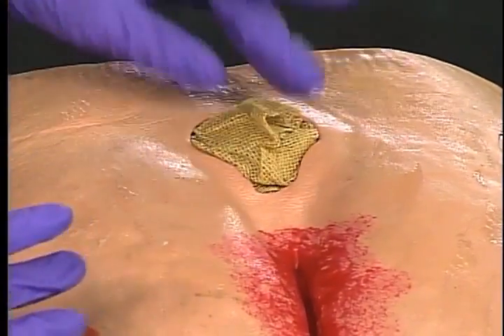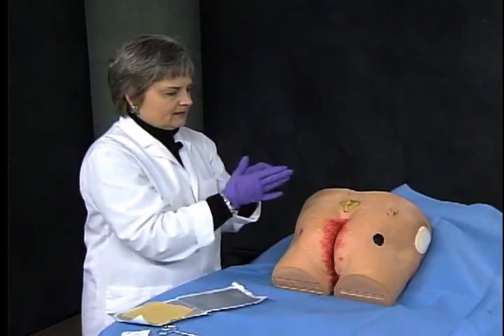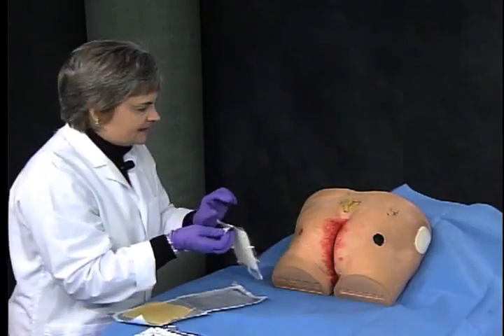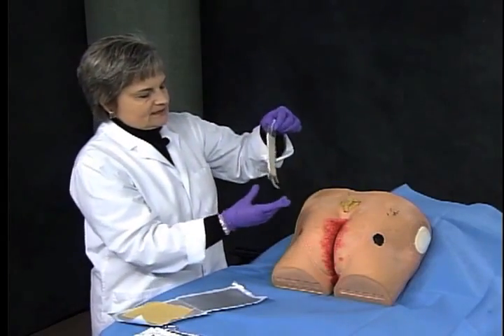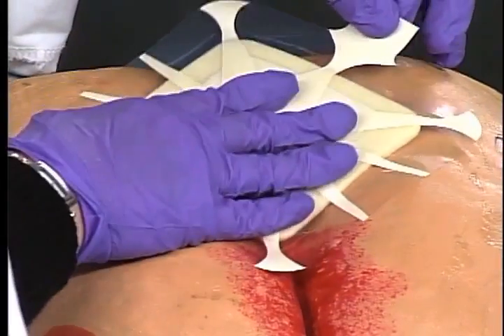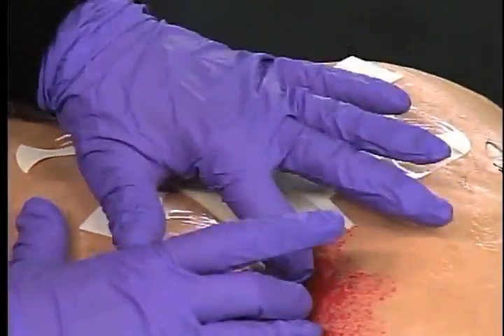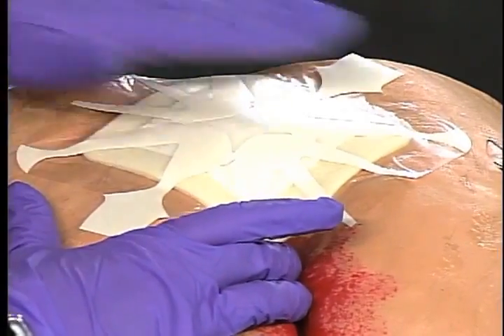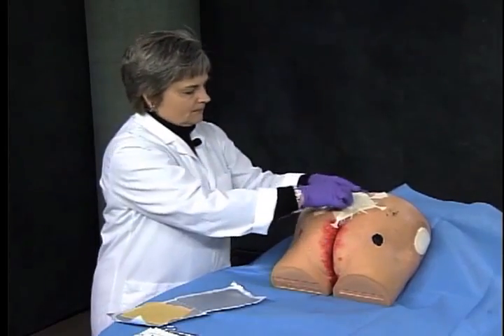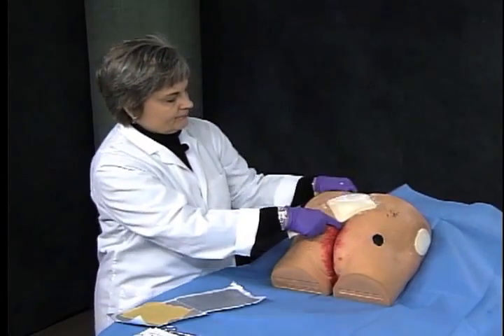Okay, so now the wound has been filled or packed, as we typically say. You never want to pack a wound very roughly or really push that dressing material in. And now again, we're ready for our cover dressing. This is another example of a foam adhesive dressing. We're just going to center it over the wound, press it down in place, and then remove the spoke delivery. And this patient, in this area of the body in particular, has excellent protection now from urine or feces. We'll just go ahead and remove those spokes so you can see the finished product. All right, very good.